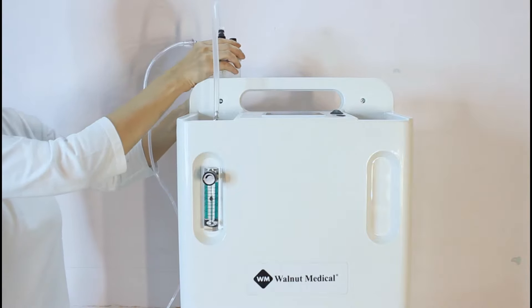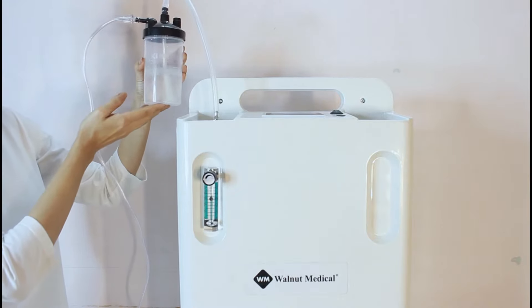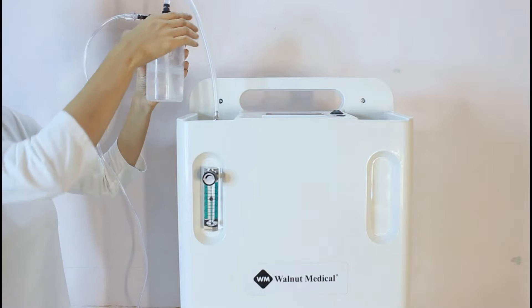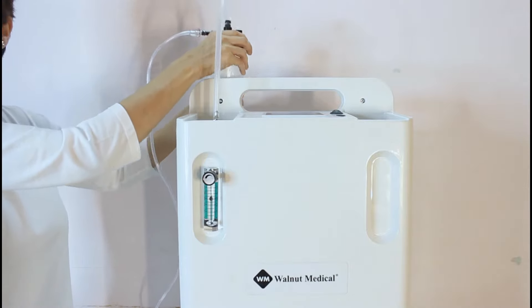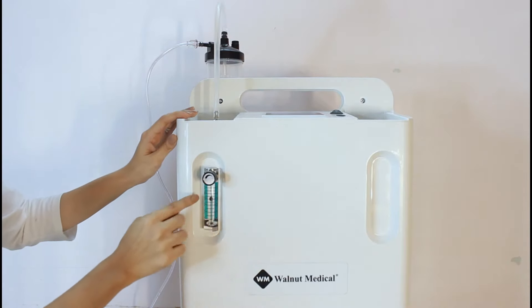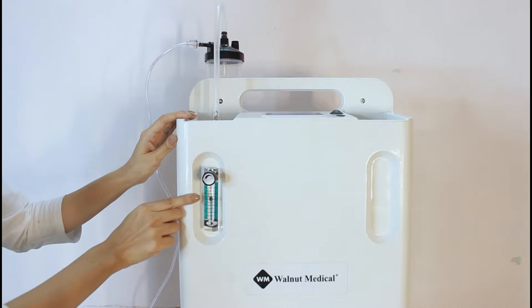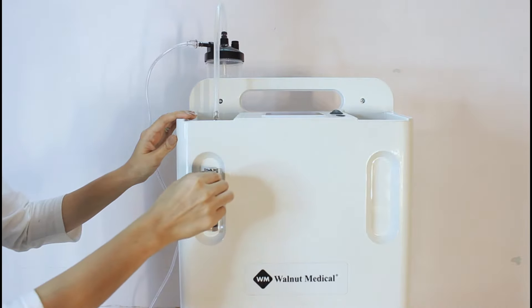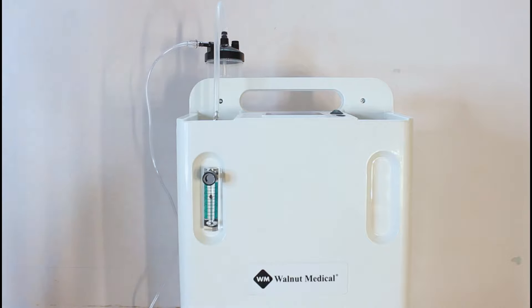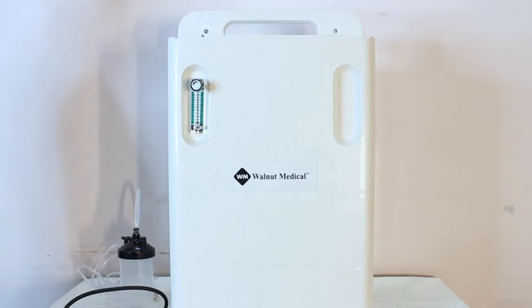You will see bubbles inside the humidifier bottle — that's where the oxygen is coming from. Set the flow rate by rotating the flow controller knob. The flow rate is indicated by the ball on the flow meter. Your oxygen concentrator is now ready to use.